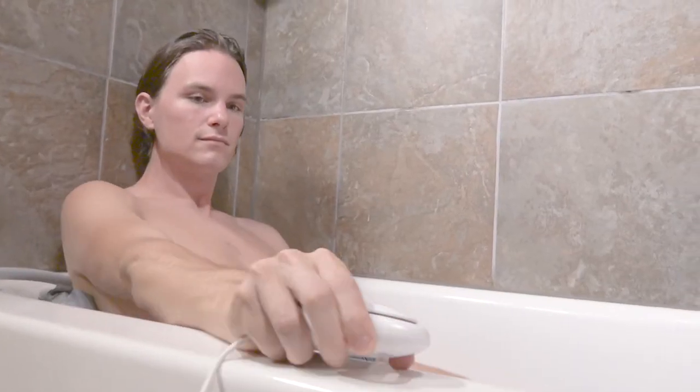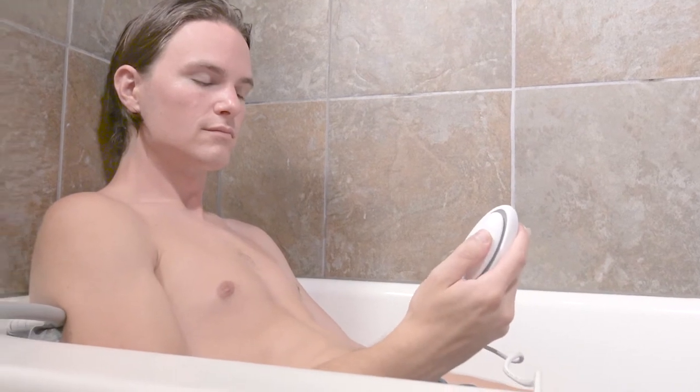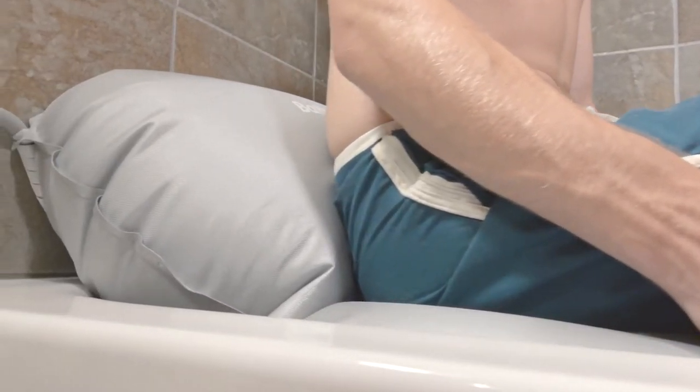When done bathing, return to a seated position towards the back of the cushion. Press and hold the up button to inflate the cushion and slowly raise yourself out of the bath. The bathing cushion can remain in the tub and easily be removed in a matter of seconds.